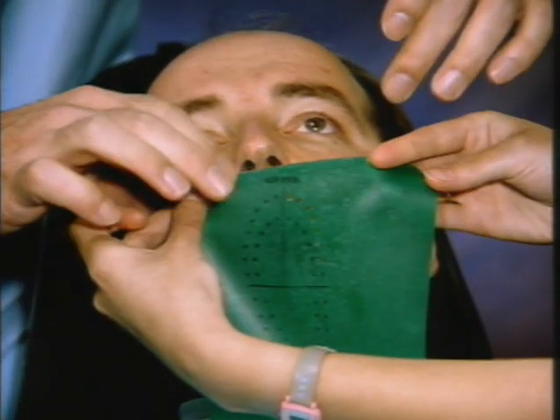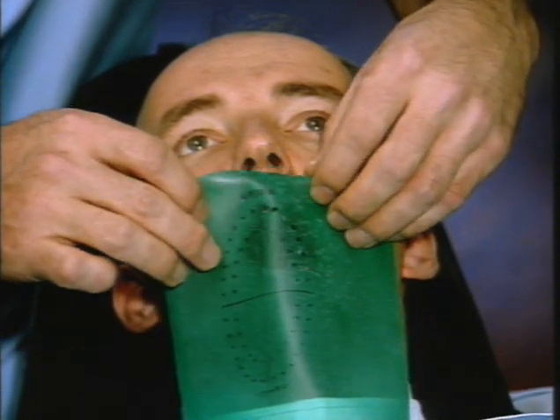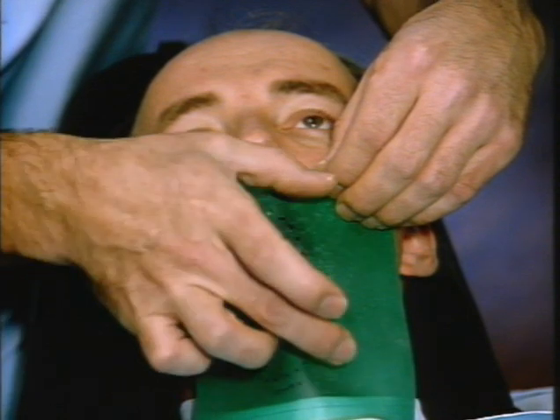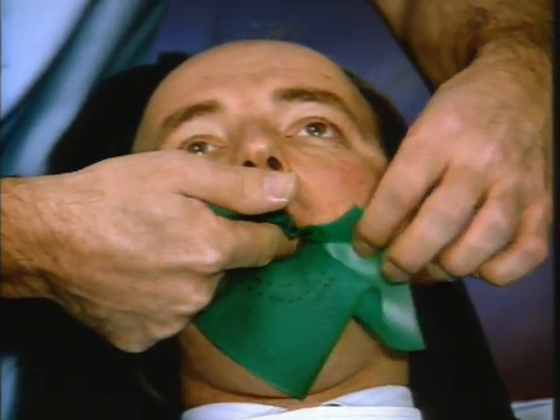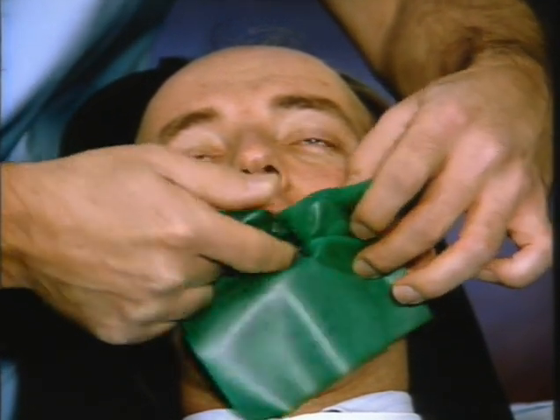If, however, the work tooth is a posterior one, then you have the problem of retracting the soft tissues on this side of the face and gaining access to the area in which you wish to work. If you place the stamp to the opposite side of the dam, then this enables you to get it in position on the tooth and to use this material on the dam to retract the soft tissues.